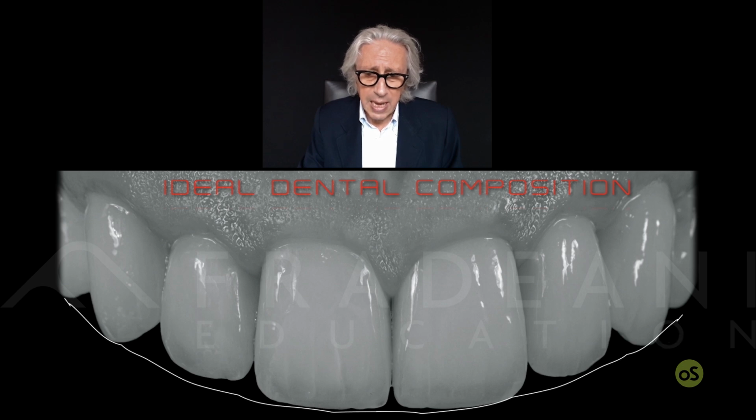We have started with incisal edge curvature, very well done, and then interincisal angles wider and wider thanks to the extension of the contact areas between the 2 central incisors that are more incisal than lateral and central and lateral and cuspid. So interincisal angle wider and wider.